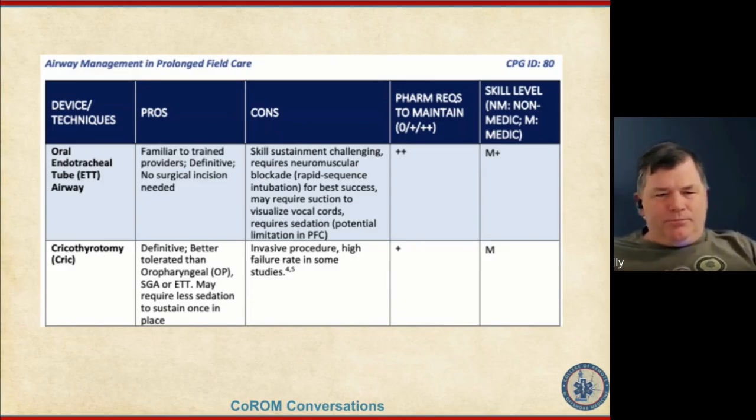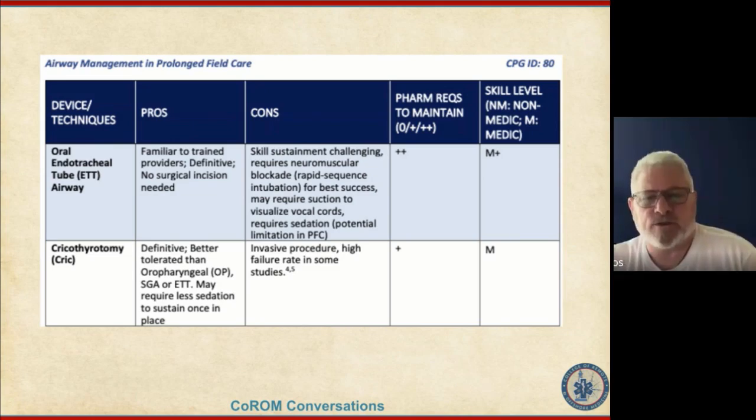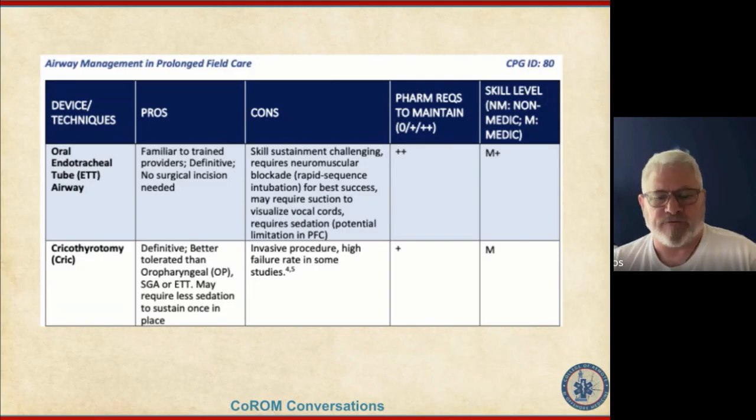Any other major cons? Well, I think everything you do when you're assessing the airway needs of your patient, none of it is going to be free. If you're bagging them, you position them properly, you're using the BVM, and they respond with their oxygen saturation improving and sitting somewhere between 90 and 96, which is your target window when you're oxygenating a patient, then that's the right thing to do.